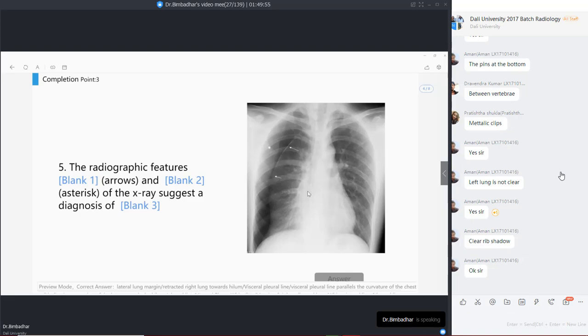That way, even if I'm looking at the left lung, you are indicating to me that there is no problem in the left lung. You just look into the right lung. Generally, write down the sides, which is fairly better.